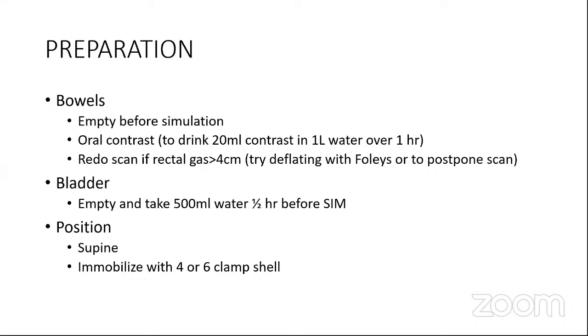One way of standardizing the bladder part is to have a fixed volume residue in the bladder. The easiest way is to use an ultrasound before the treatment fraction for the patient every day, and then see how much volume is there. If there is less volume, you inject volume through a Foley's and then you keep it stable. But that becomes more cumbersome. We can't keep a Foley's in situ for the entire duration of the treatment. Of course, we do that in some prostate cancers with urinary obstruction. But in a cervical cancer scenario, we don't recommend that.